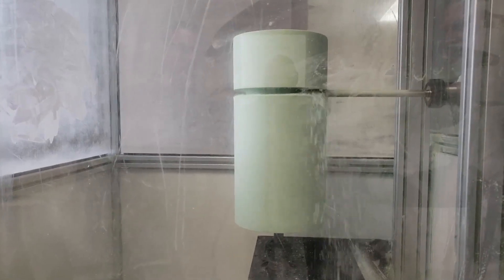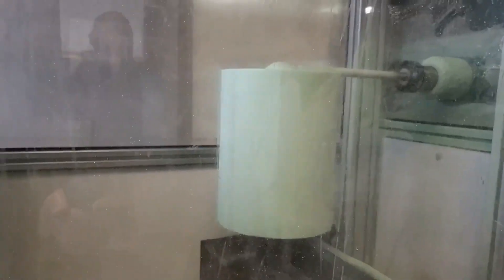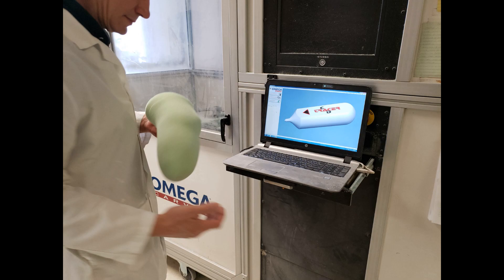The foam blank has been mounted into the carver and we will see a video of the carver milling its shape. In real time it takes 10 to 15 minutes, compared to the old handmade version which could take hours in some instances. So it's not only time-saving — it's more accurate and more trackable.